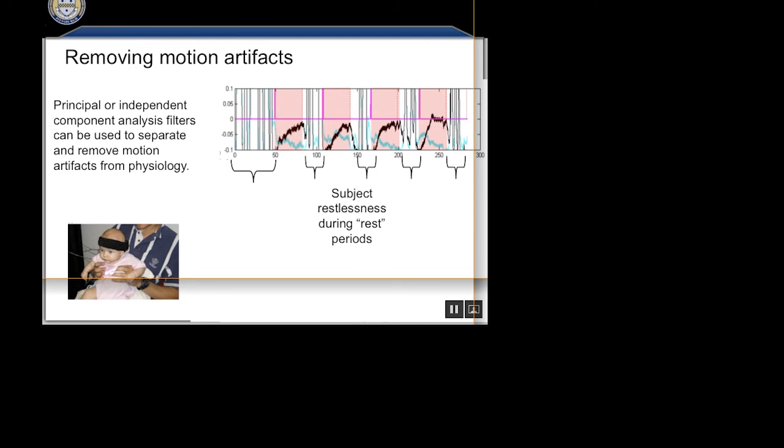When we do PCA for physiology, what we typically do is we calculate it separately for oxy and deoxyhemoglobin, because we know the spatial pattern: oxyhemoglobin has more cardiac, deoxyhemoglobin has more blood pressure, and they're going to have slightly different spatial patterns. So we compute it separately for the different wavelengths or the different types of data. With motion artifacts, there's no reason to believe that the probe lifted off the head and only affected oxyhemoglobin and didn't affect deoxy. It doesn't care. It's just the whole probe, all the signals across all your wavelengths change the same way.